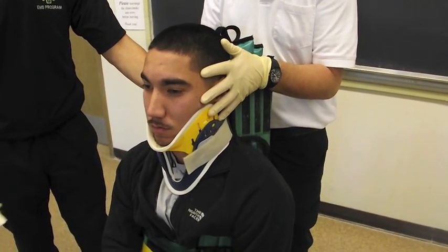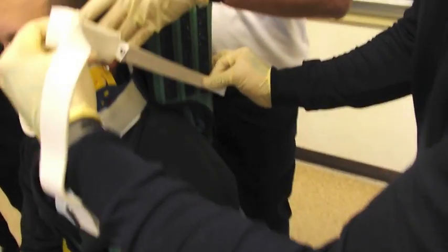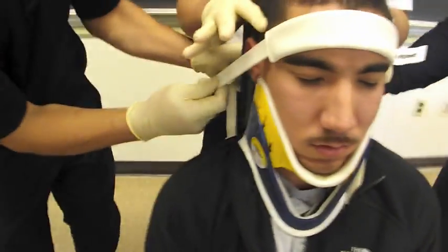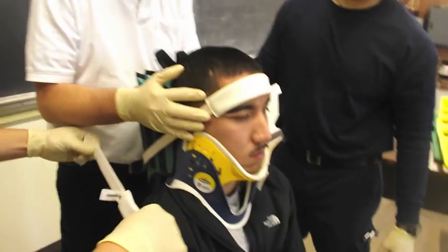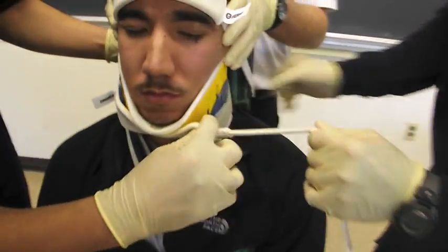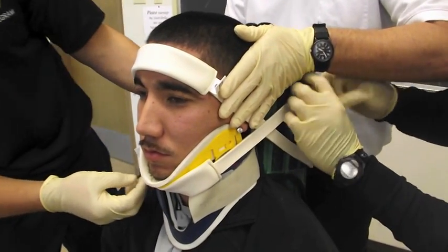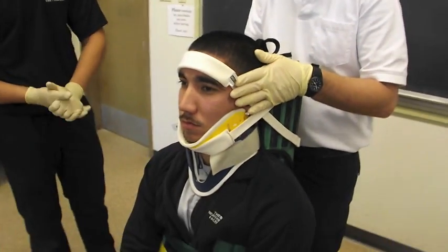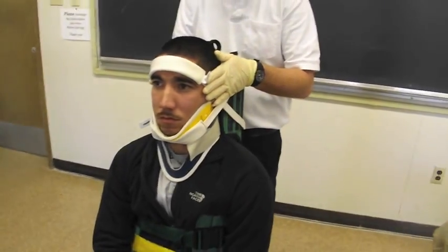Now we're going to put the straps on so that the head is immobilized to the KED device. Louis is putting the forehead strap on first, starting low below the ear, and Marcus is coming across the top putting it low again — this promotes the patient's head to stay back in the immobilized position. To put the chin strap on, he'll do the exact opposite, forming an X along the Velcro side of the KED, going under the chin and back up over the ear. At this point it would be important to reassess CSMTP.